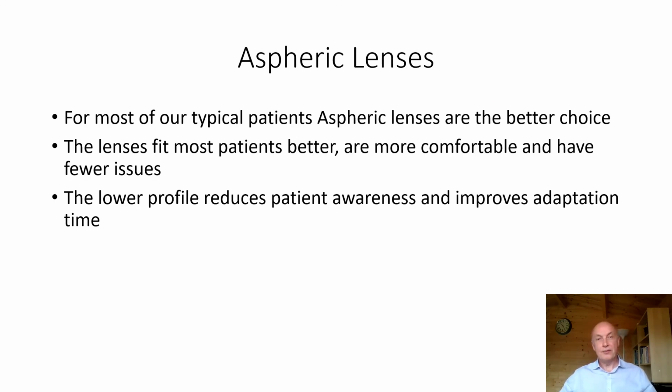For most patients, average patients, aspheric lenses are a better choice. They fit better, they give better comfort, there's fewer long-term issues. The lower profile and thinner lenses reduce initial patient awareness and speed up the adaptation time. So we recommend that you fit aspheric lenses as a first choice lens.